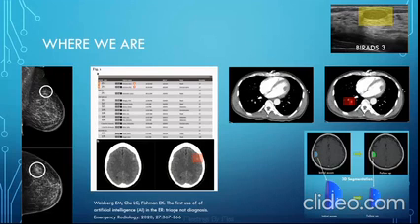In the right of the image, we have 3 more AI applications. Working from top to bottom, we have an ultrasound application that analyzes breast lesions and assigns a BI-RADS score, an application that detects pulmonary emboli, and an application that performs 3D segmentation of intracranial tumors.